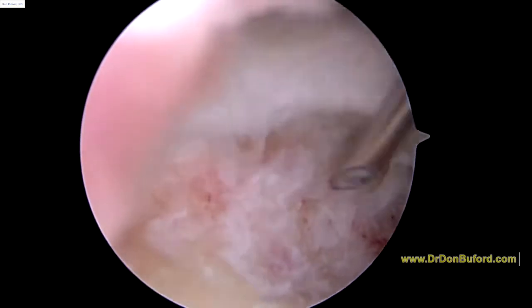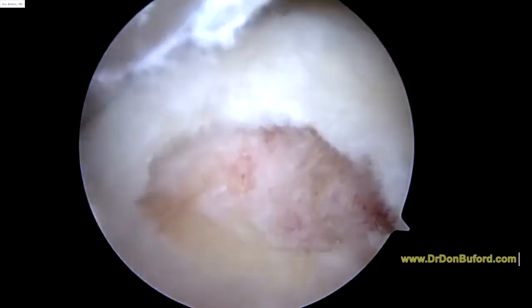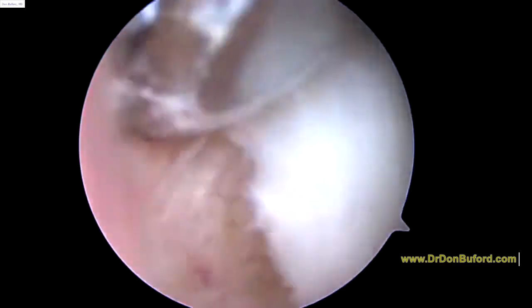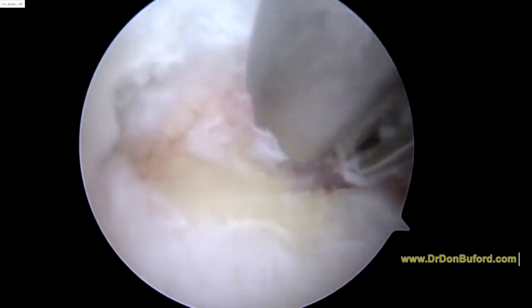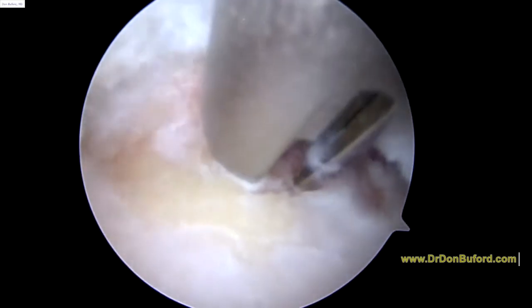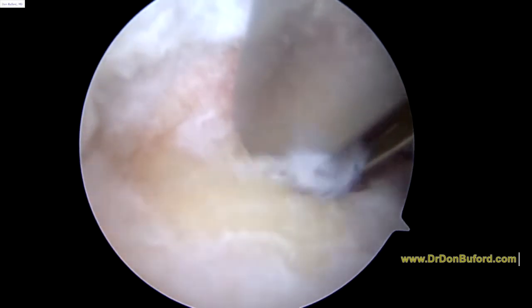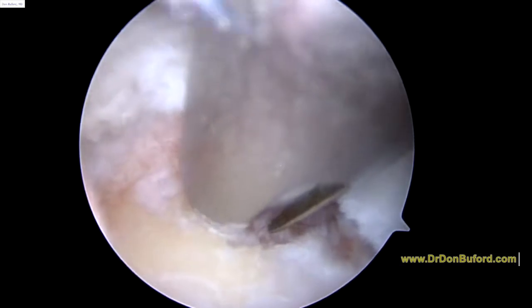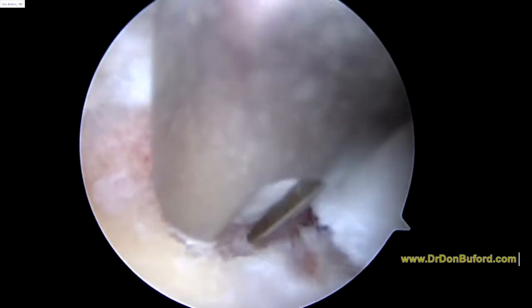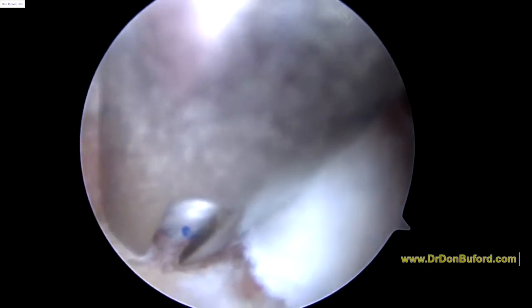Okay. This is our guide for our anchor. A little bit bigger than the spinal needle, as you see. And again, there's the hole. We're going to place this down really right about here. I like that position there.